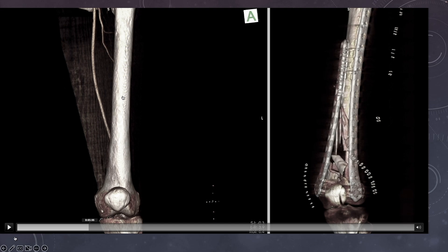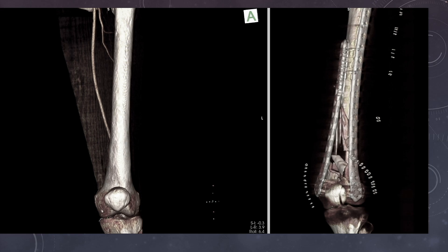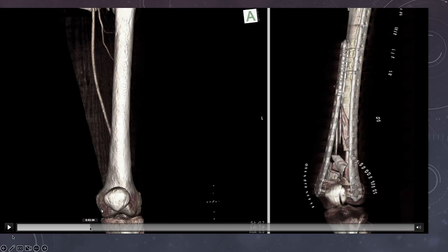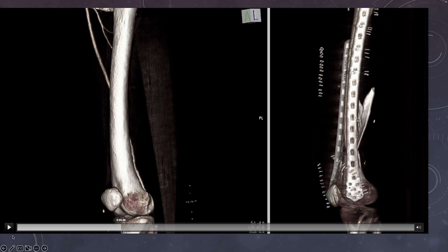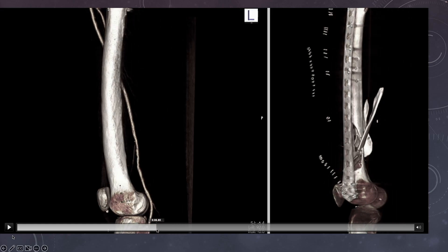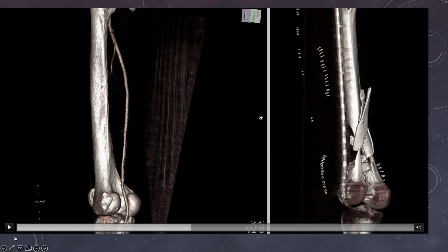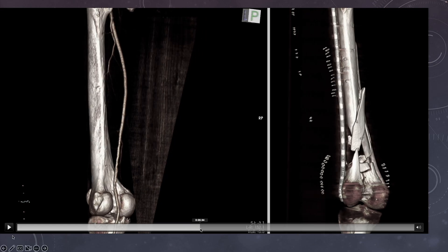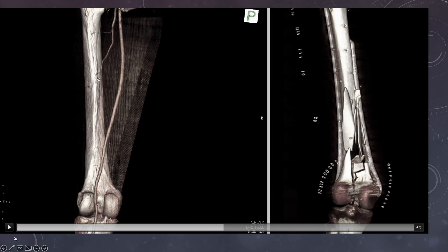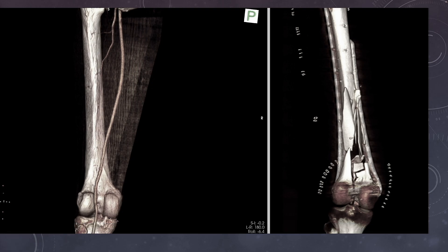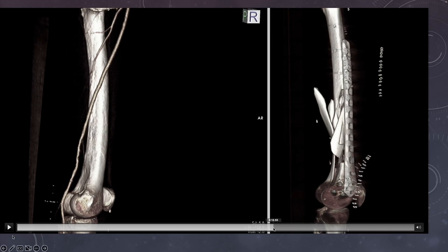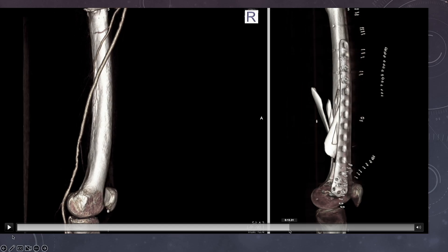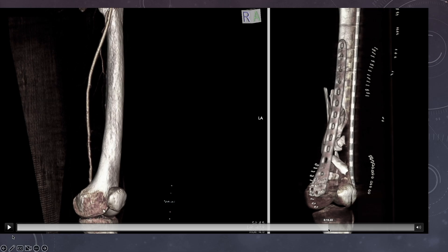This is the plane we want to enter. The medial plate is passed from distal to proximal so that it remains over the diaphysis, and we can titrate the position so that it faces in an anteromedial direction. In the proximal part the vessel is quite clear even on the medial side, and we are going to use the anteromedial surface. On the posterior side, the vessel is in vicinity with the femur in the notch area — between the two condyles posteriorly — otherwise the vessel is quite clear of the femur. The branches of the vessel go directly posteriorly, not on the anteromedial or direct medial surface of the femur.